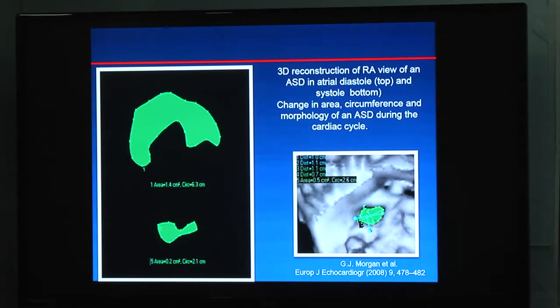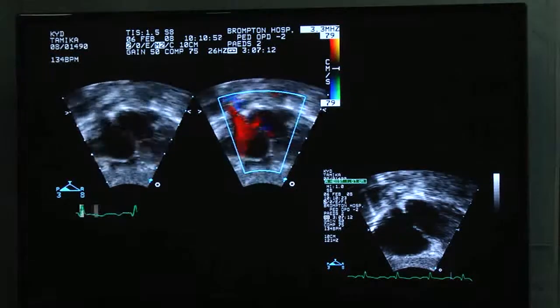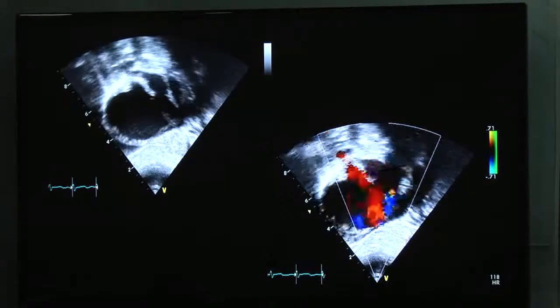Okay? So people a lot of the time fail because they have set ASD as 22 millimeters on the TEE, but it is not in the maximum diastole. Okay? So then if you take a 24 device, it is never going to sit. Or if it is going to sit, the chances are that it will embolize. So you need to take the diameters properly. I'll just skip this because I think the time is the essence, isn't it?